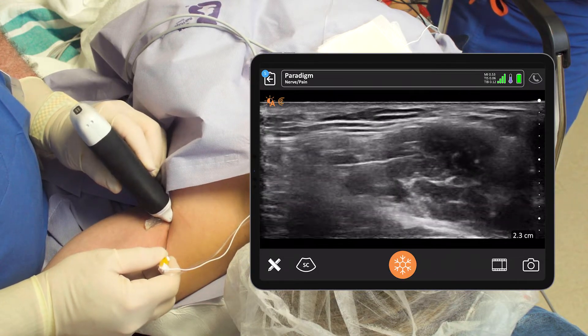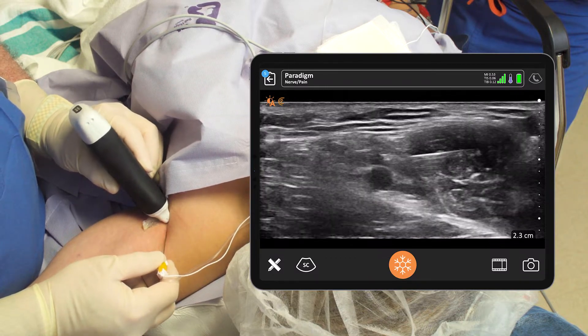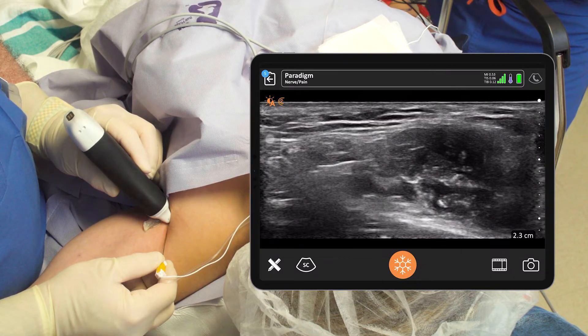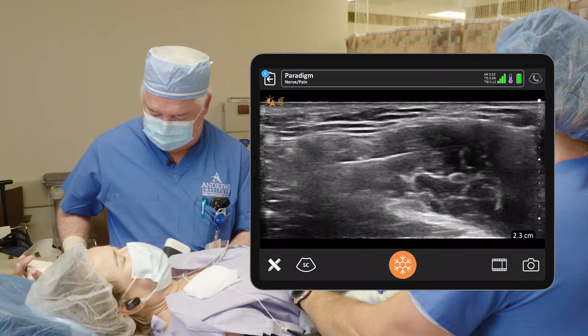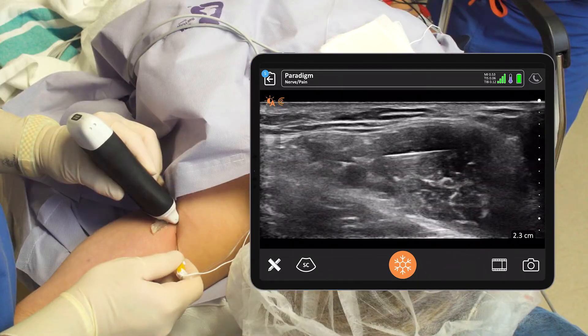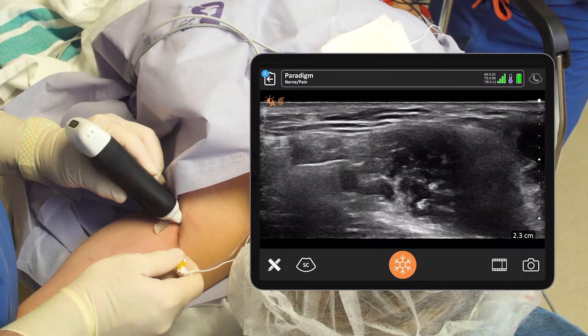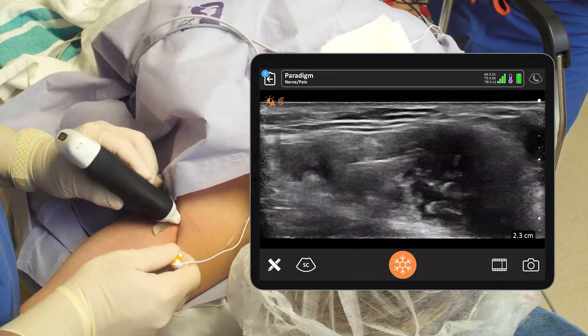Then we're going to advance on back and find the ulnar nerve posteriorly — that should be right back here. There's our ulnar twitch. Give me five right back there: one, two, three, four, and five.